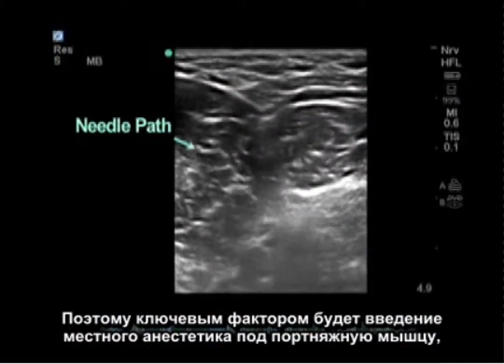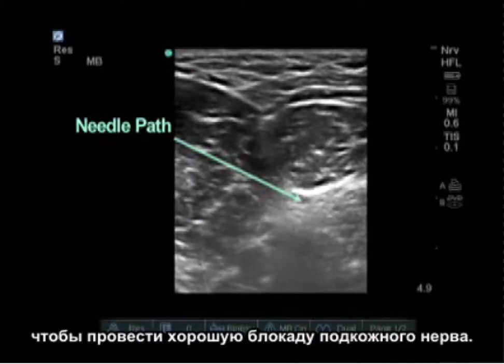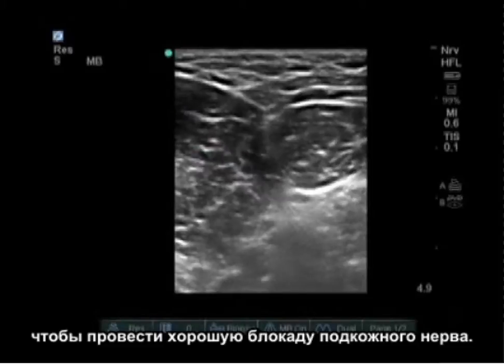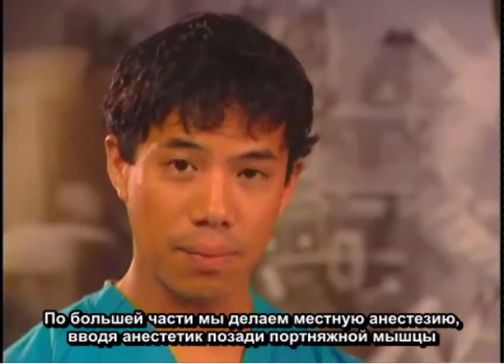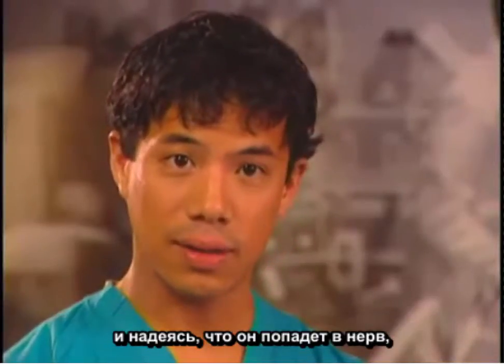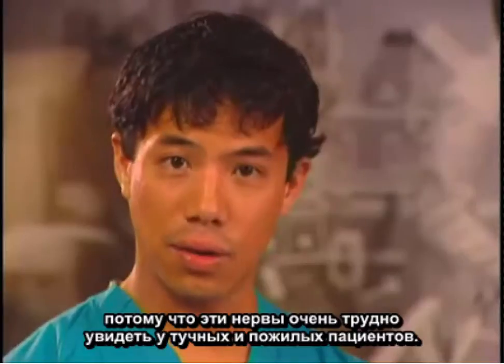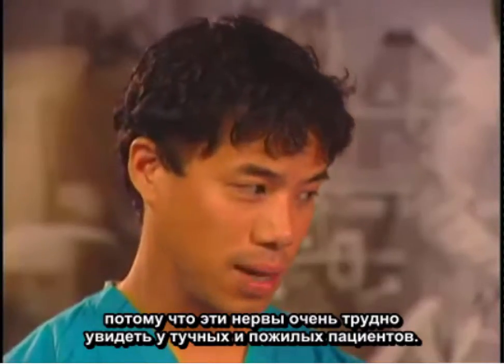The key is that we place our local anesthetic below the sartorius muscle in order to get a good saphenous nerve block. Most of the time we're doing a field-type block where we deposit the local behind the sartorius muscle and expect that the local will reach the nerve, because these nerves can be difficult to see in obese or elderly patients.